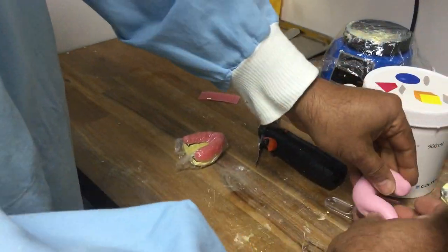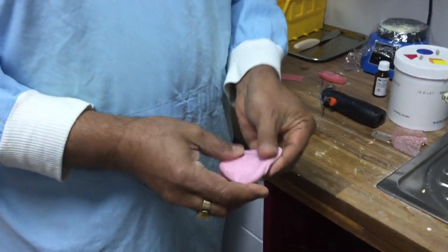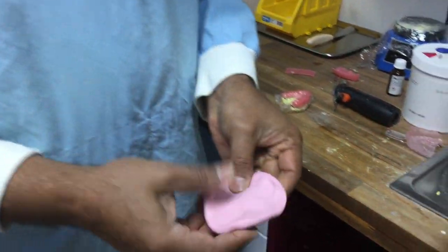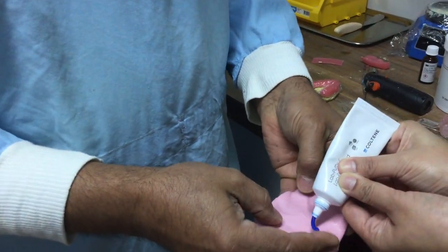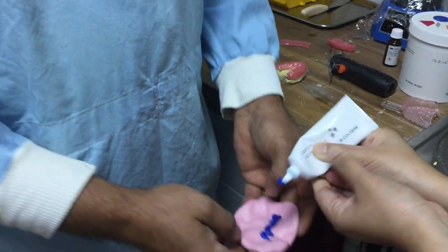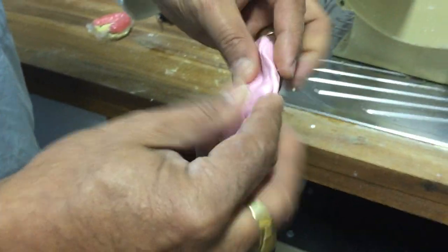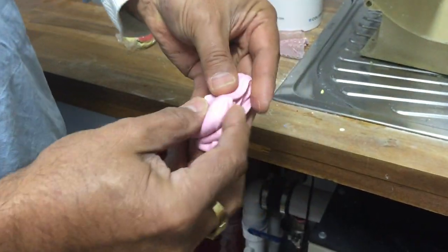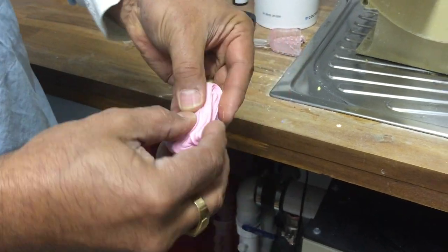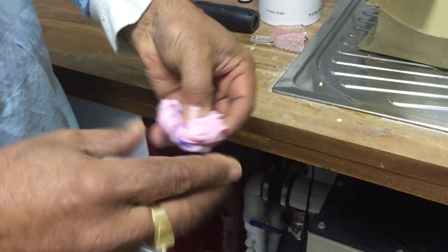I've worked out how much putty I'm going to use to fill that tray. This is really important — when mixing the putty, I make a pancake. I'm putting a little bit more accelerator than normal and I just fold that in so it's sealed. The first thing I do is stretch it so I'm not getting accelerator on my fingers or gloves.